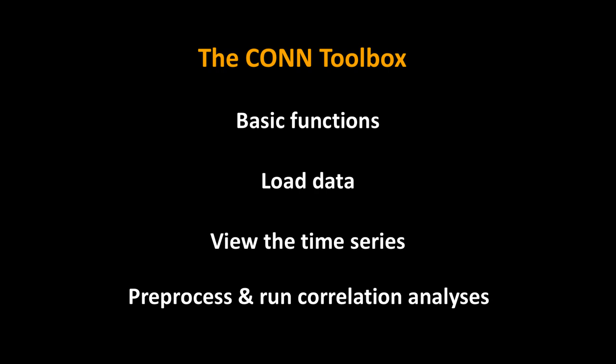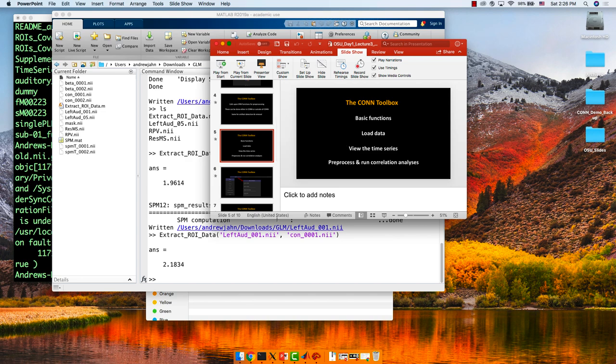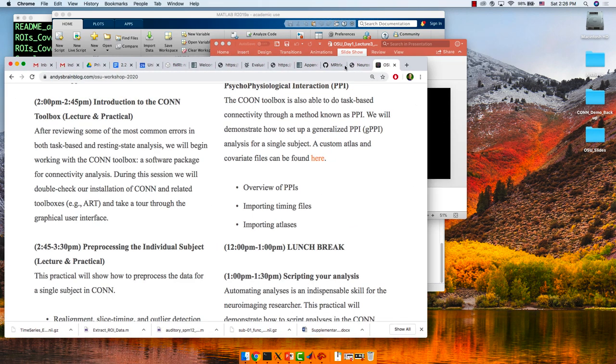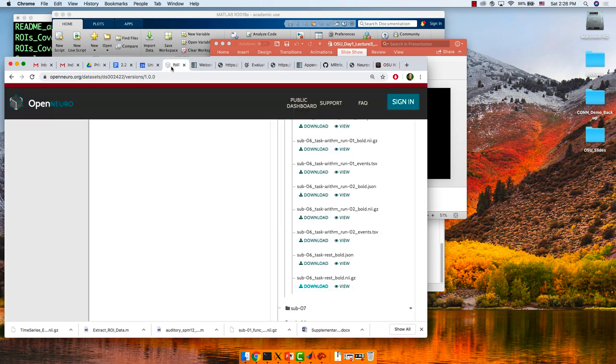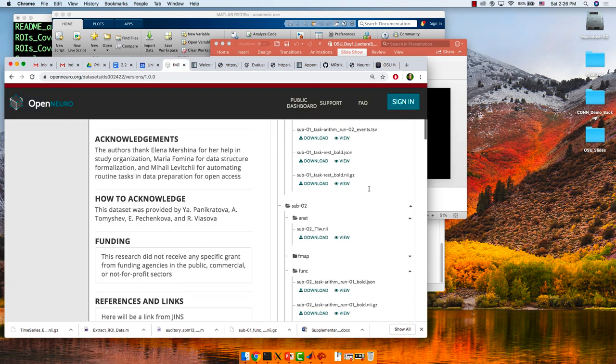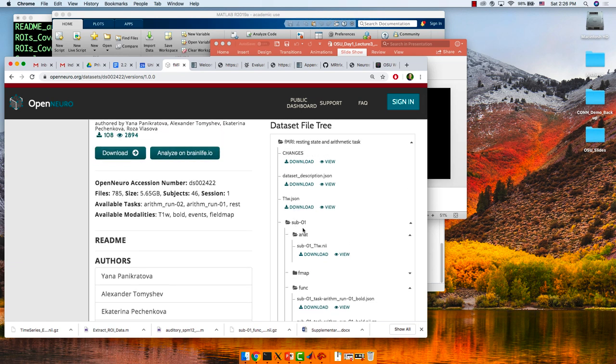One thing I want to come back to is something called the BIDS format — Brain Imaging Data Structure. It's a relatively new, standardized way to organize your data. I'm going to go back to this OpenNeuro website to show you what that looks like.